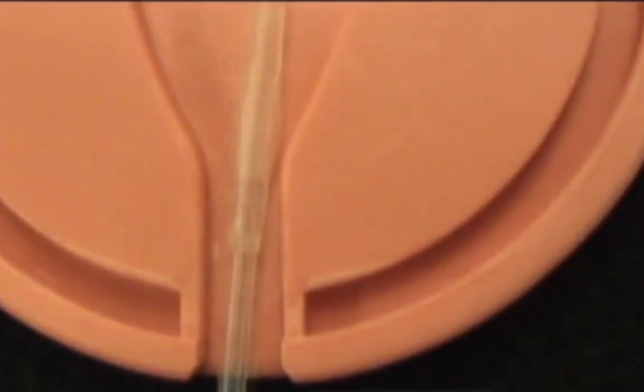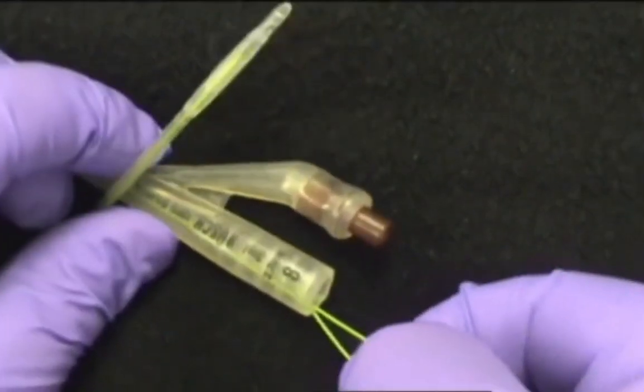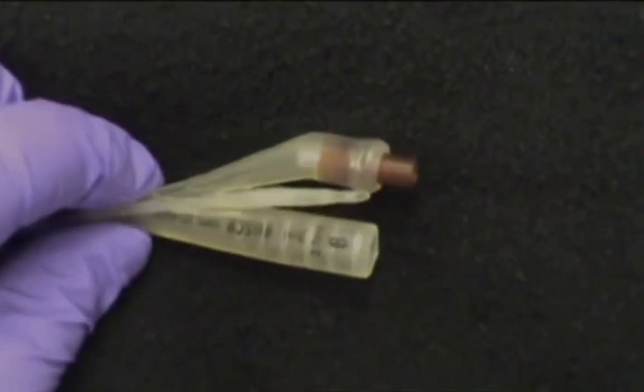A very good seal and less painful is achieved by inflating the balloon inside the uterine cavity and then gently pulling back to seat the balloon in the lower uterine segment. After insertion, the plastic stiffener needs to be removed before the saline can be injected.